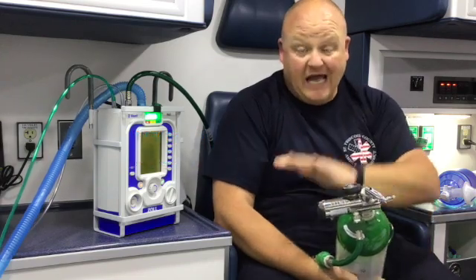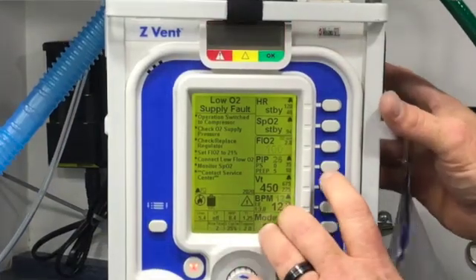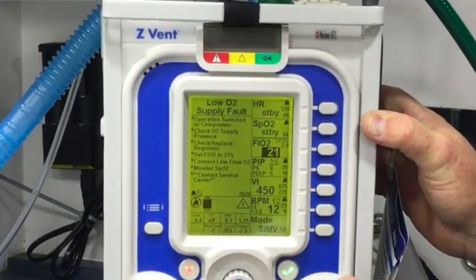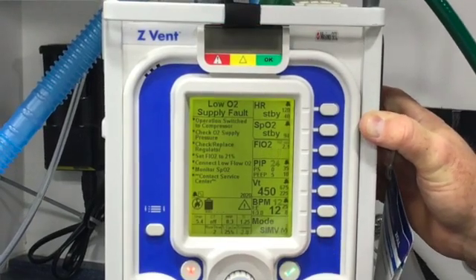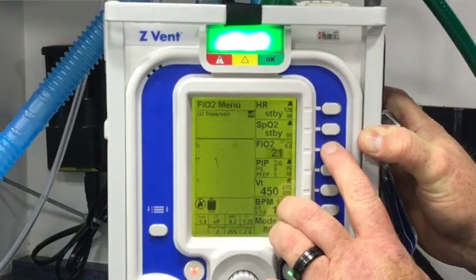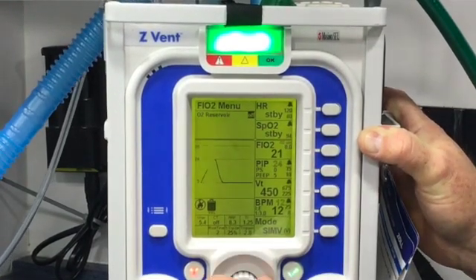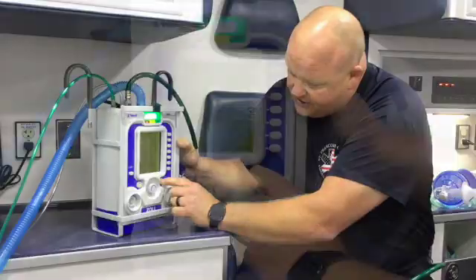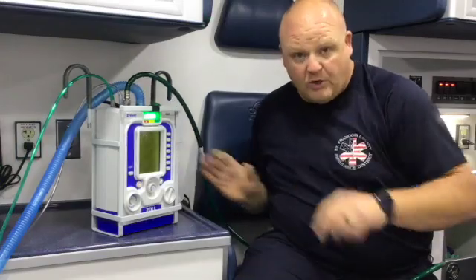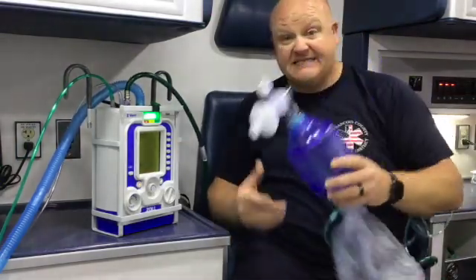The second thing you can do is bypass the high pressure system altogether. Come to your vent, immediately turn your FiO2 down to 21%, confirm it, then press and hold the FiO2 button, turn it on, and confirm it. Now you should have a plus sign next to the 21.